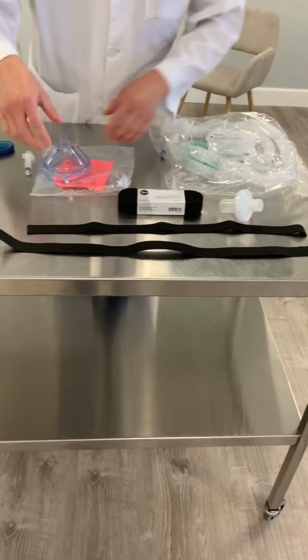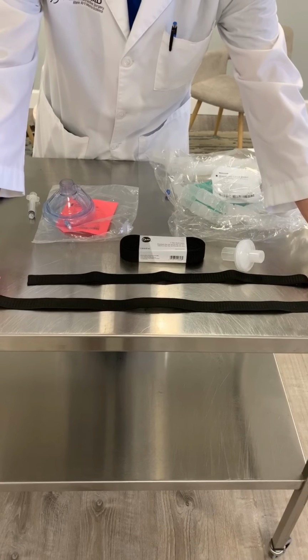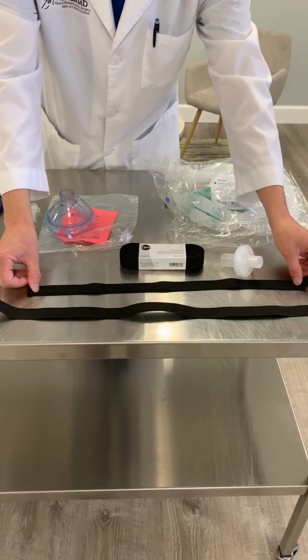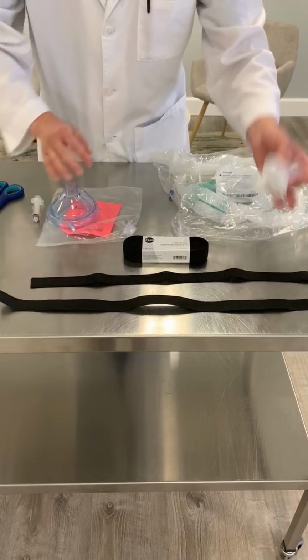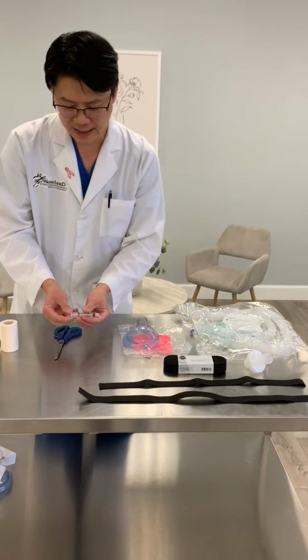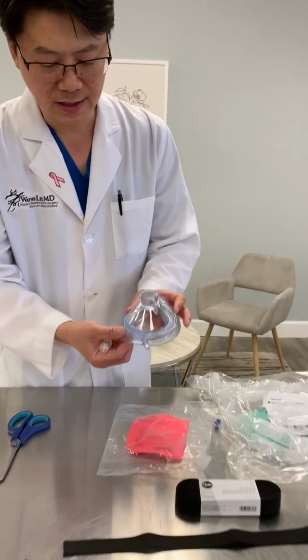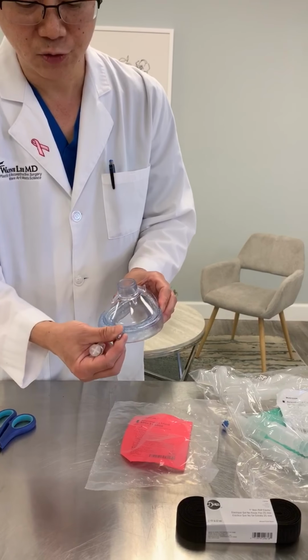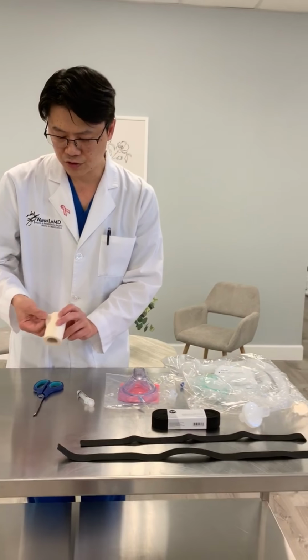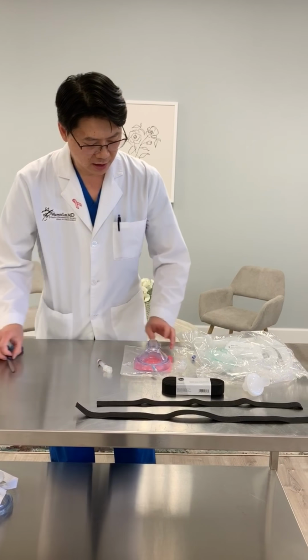For adult size, we measured that the upper band elastic will be 62 centimeters, and the bottom band around your neck will be 52 centimeters. So I pre-cut that. Here's one of the antiviral filters. There's a 5 cc syringe. You can adjust the amount of air in this anesthesia mask to allow for a better fitting. You need a pair of scissors and some surgical silk tape, which is very easy to obtain.